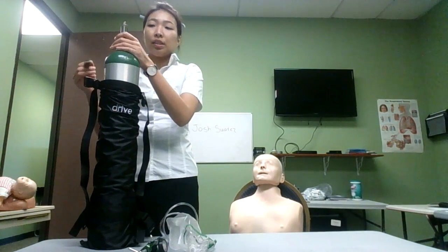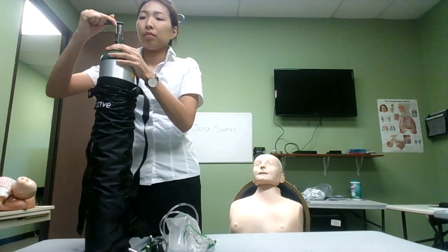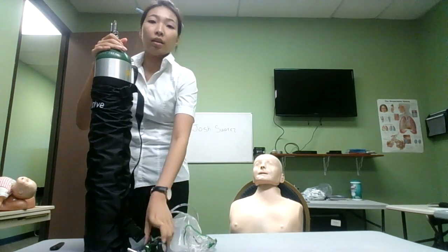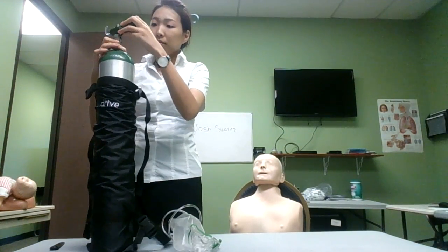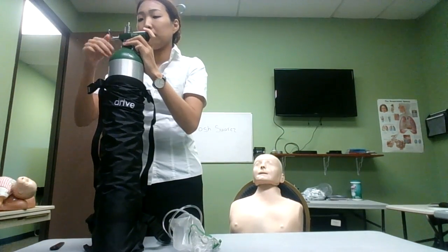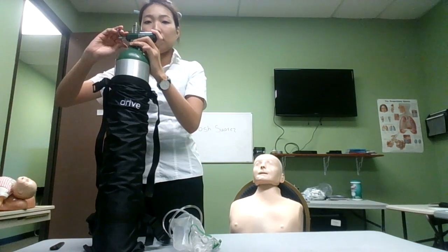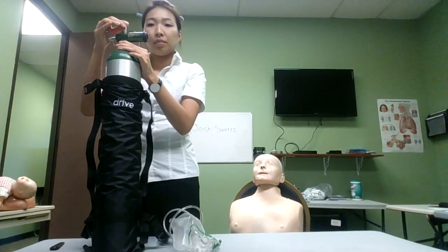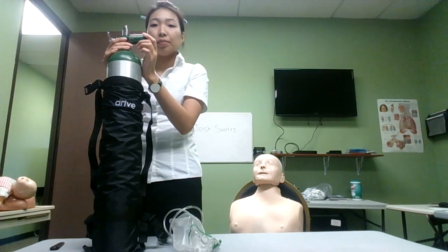Crack the valve on the oxygen tank. Assemble the regulator to the tank. Open the oxygen tank valve. Check oxygen tank pressure — it's 2000 psi.